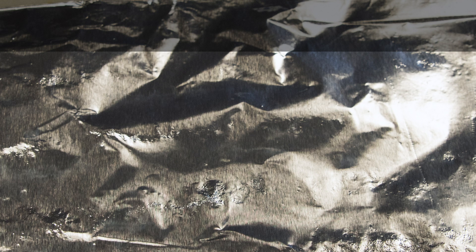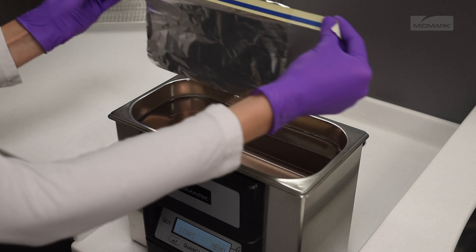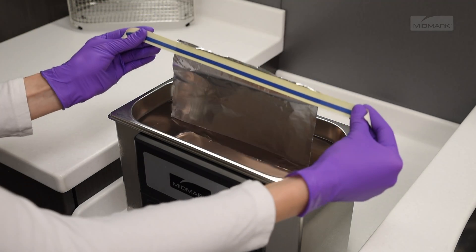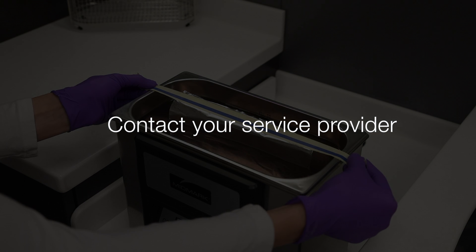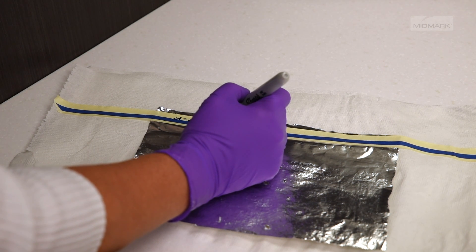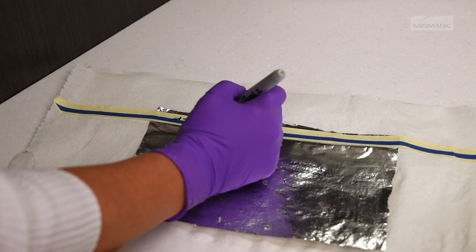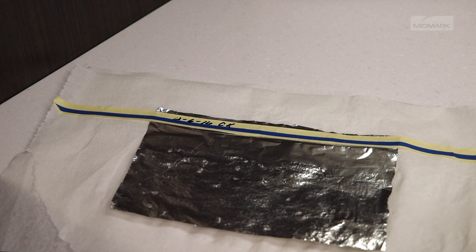The entire submerged area of the foil should be uniformly pebbled with tiny dimples from the ultrasonic implosions. Areas greater than one inch diameter — the size of a quarter — that don't have pebbling may indicate a problem with the ultrasonic unit. If the results indicate a possible problem, repeat the above steps using a new foil sample. If the results are the same, contact your service provider to have the unit evaluated or repaired. If the results confirm uniform cavitation, dimpling, and pebbling of the foil throughout the tank, label, date, and save the foil test sample for future comparative purposes.